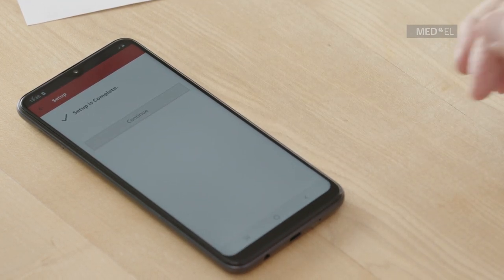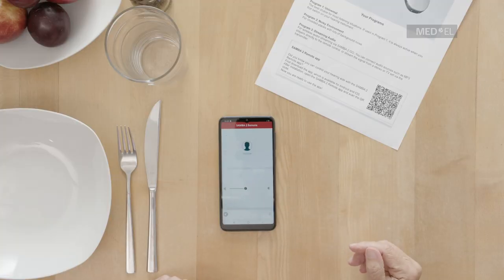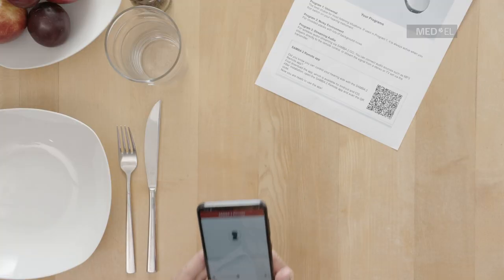Your setup is now complete and the Samba2 Remote app is now ready to use with your audio processor.